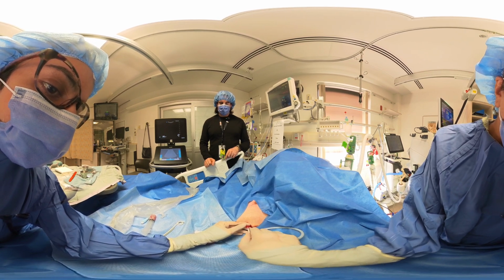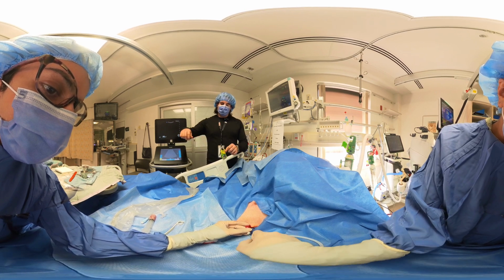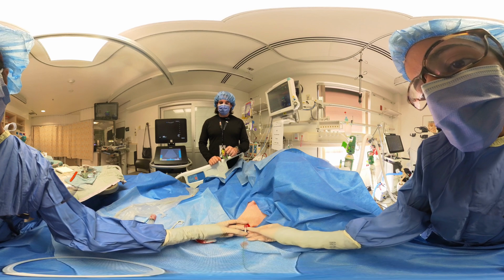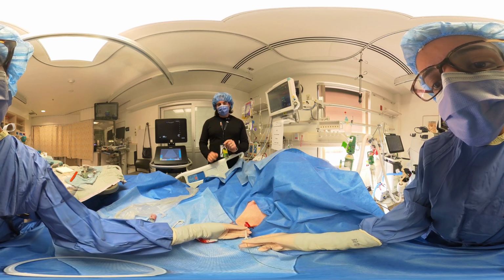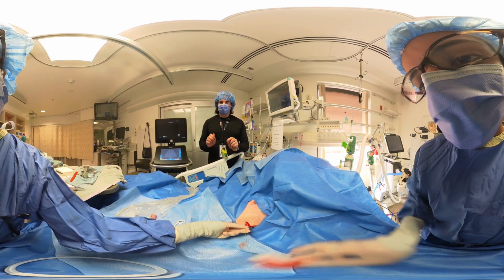Once we get to like 15 centimeters or so, it's probably okay. So we can take the plastic wire holder off. Yeah, just make sure you don't lose track of the end of the wire. That's perfect. Okay, so from here the needle and this can come out. Okay, we'll leave the wire in place. This is Seldinger technique.